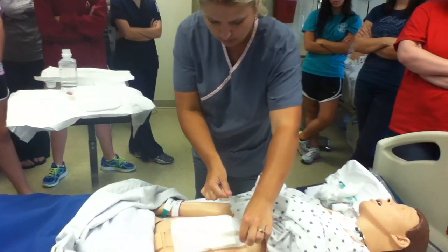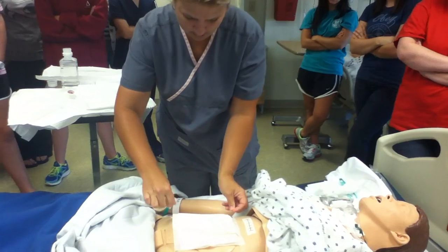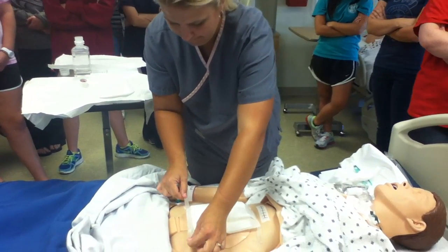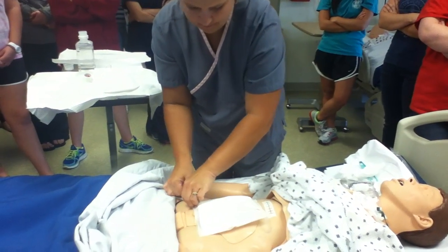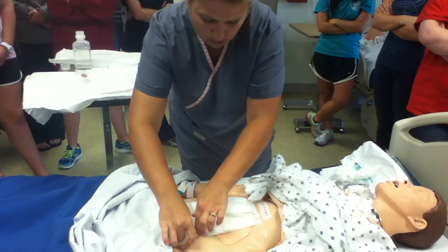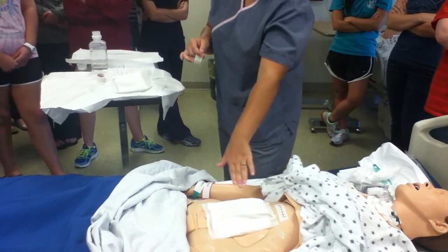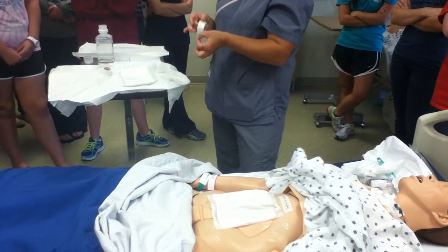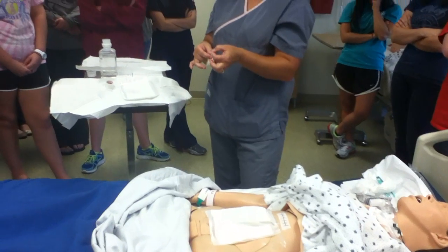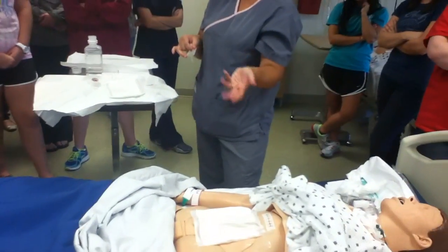I'm going to tape my wound, which my tape is a little bitty because it's been torn. You're just going to tape all the edges to make sure it's secure. I am going to put another piece of tape on the patient, on the wound right here, saying what the day is, the date, what the time is, and my initials, basically that I did that dressing change that particular time and that day.